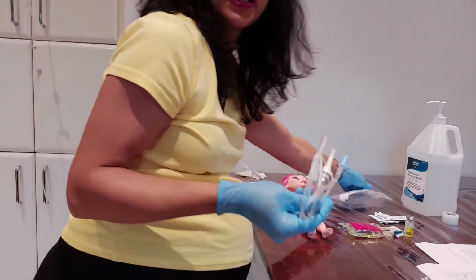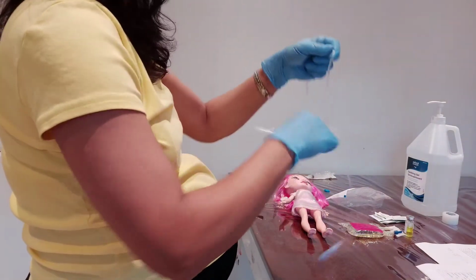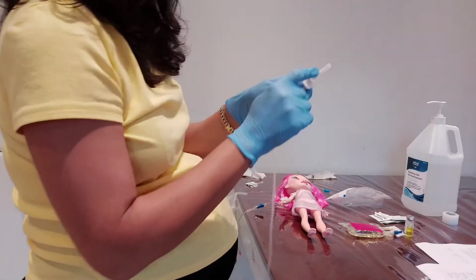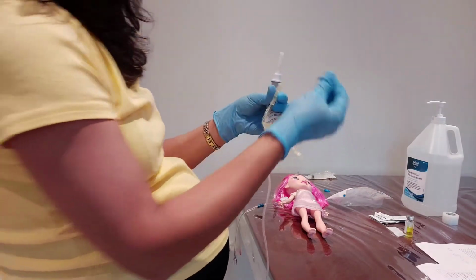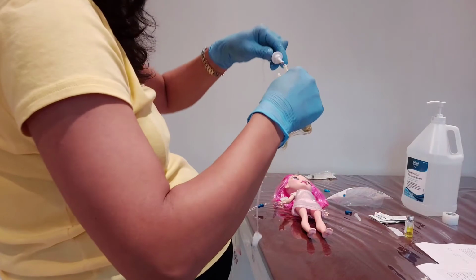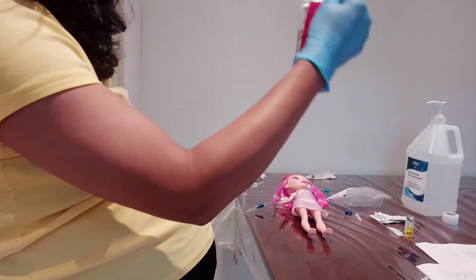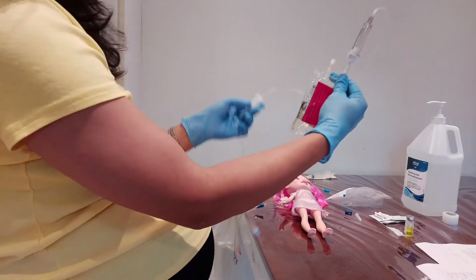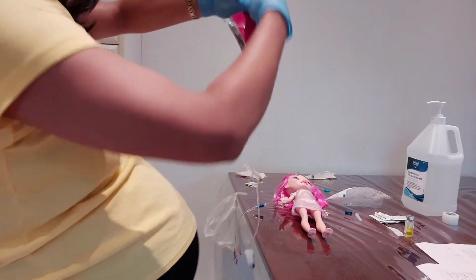I will use the secondary line. I know it's clean. It's clean also. I will recap it, and this one too. I try to put it together and make sure that it's closed. First, I have to make sure that the clamp is closed in order not to waste any of the medication.